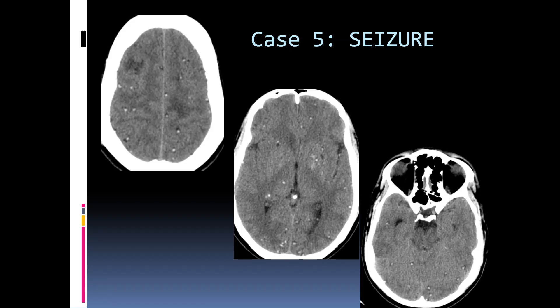Here we can see abnormality in bilateral cerebral hemispheres. Multiple cystic lesions are noted with an eccentric hyperdense scolex, and some of these lesions show surrounding edema. This is a case of disseminated neurocysticercosis, which is very common in India, and so this would be either the vesicular stage or colloid vesicular stage.